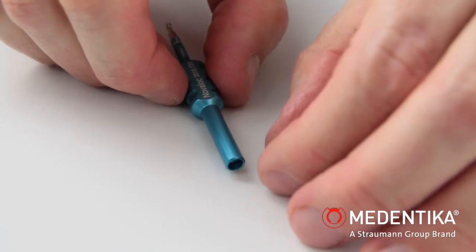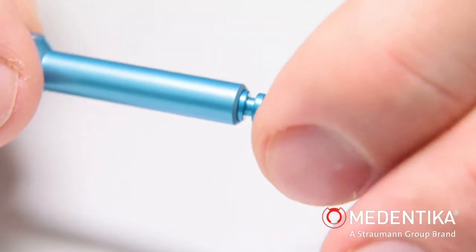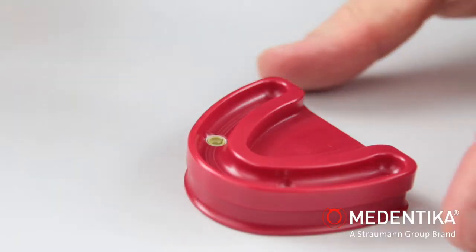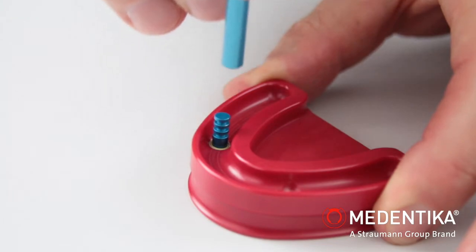Function 2: The opening on the opposite side is used for attracting a laboratory implant. The laboratory implant can be reliably repositioned in the impression, or anchored, as here, in the matrix.